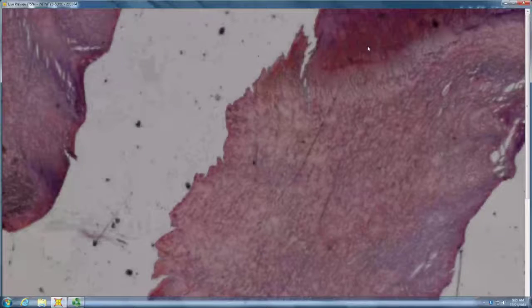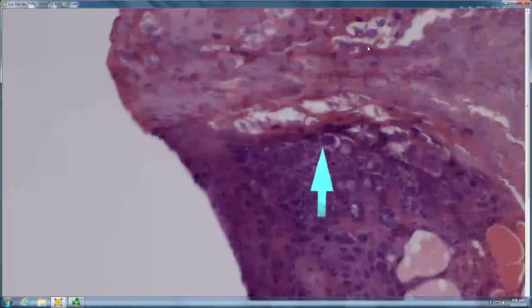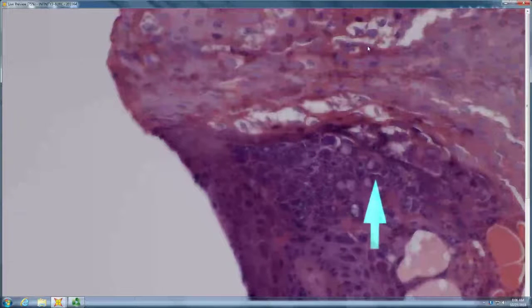Which is stratum corneum. So stratum corneum with parakeratosis, and then we have some underlying... Myrmecia with the red inclusion bodies in the wart. So myrmecia meaning anthill, referring to the anthill-like morphology of the lesion clinically.